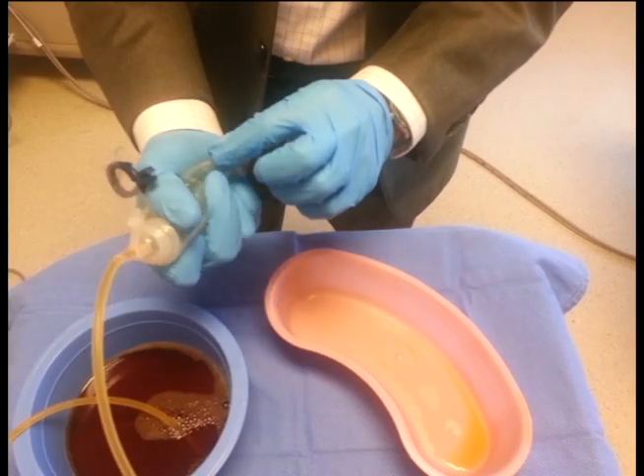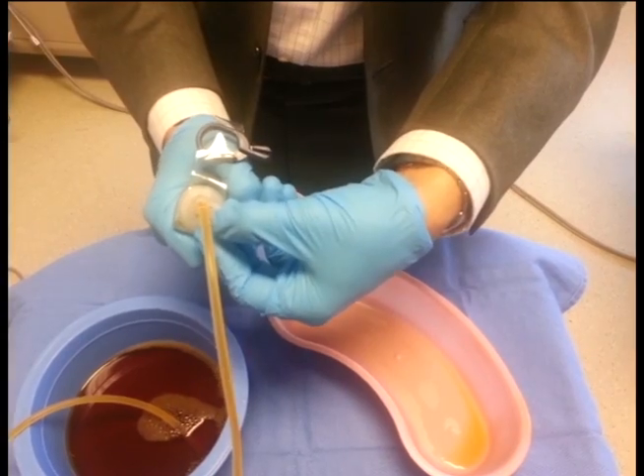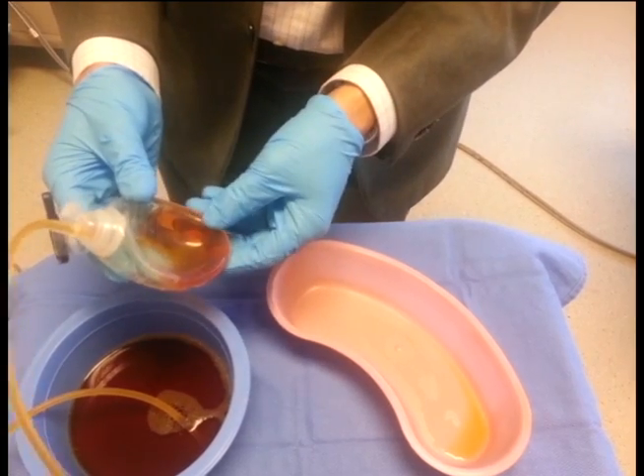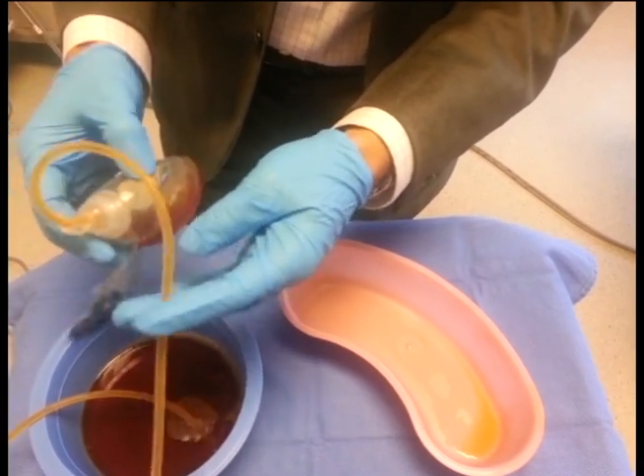Squeezing the bulb creates negative pressure, and we replace the tab while we're squeezing the bulb. That allows the fluid to be pulled away from the body into the drain reservoir.